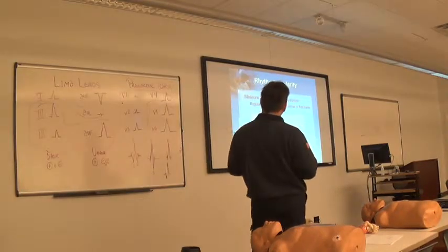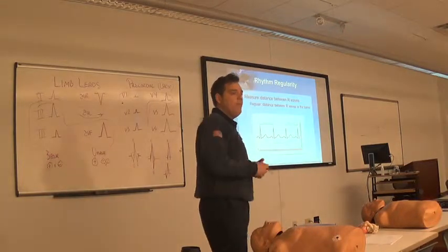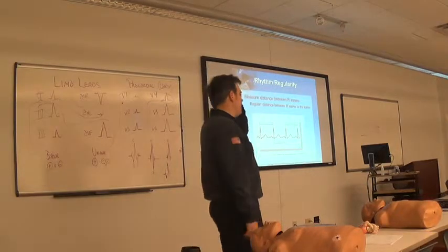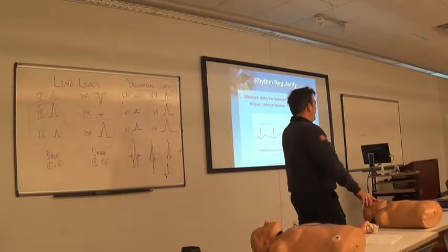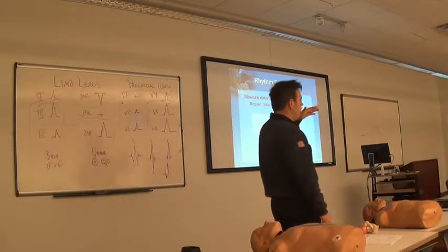All right, so here's how we do regularity. I would suggest that you go out and buy little calipers. Where can they get calipers? I'm trying to think who would have them. Maybe an academic store, a teacher store, or any of your bookstores like that.